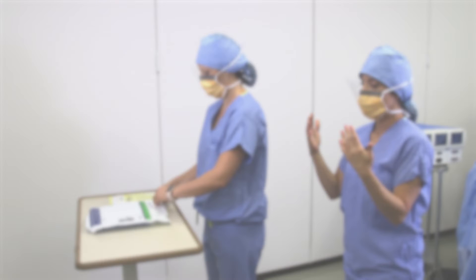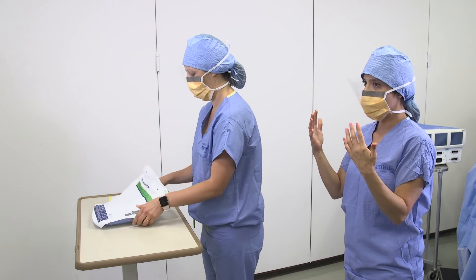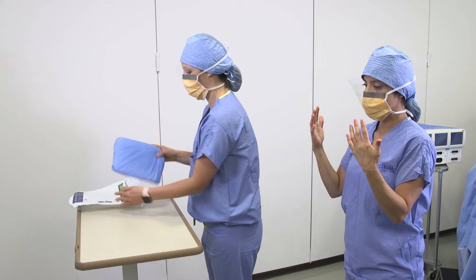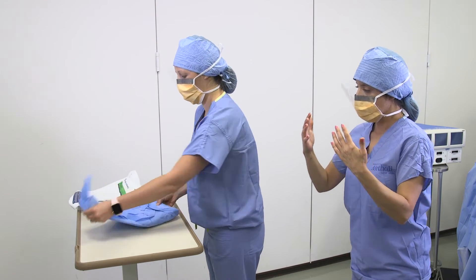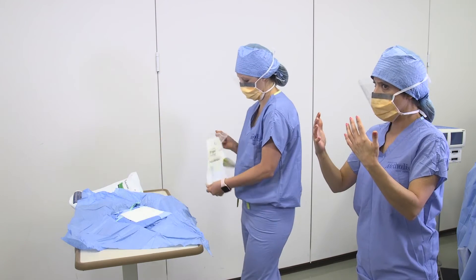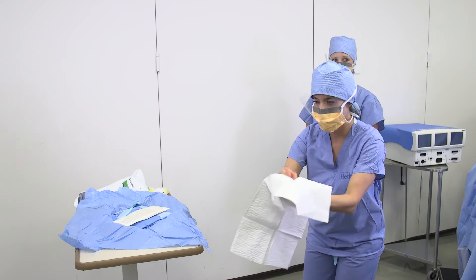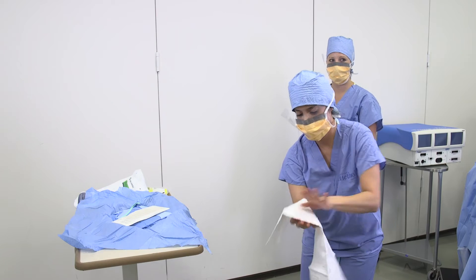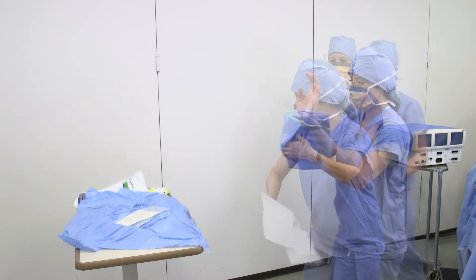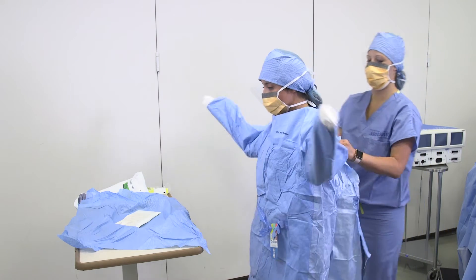We will begin by demonstrating how to put on a sterile gown and glove located in your emergency open chest cart. First, a non-sterile team member will open the sterile gown and gloves and place them on the table. The sterile team member will open the gown and slide their arms through the holes, keeping their hands inside the cuffs.